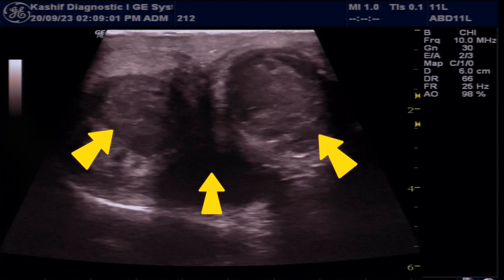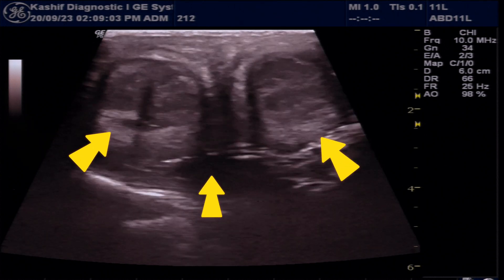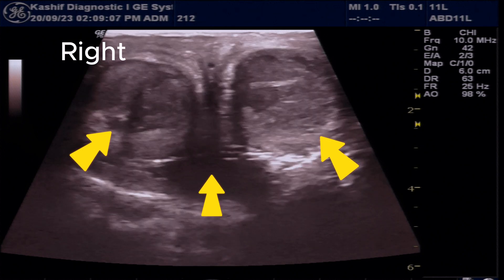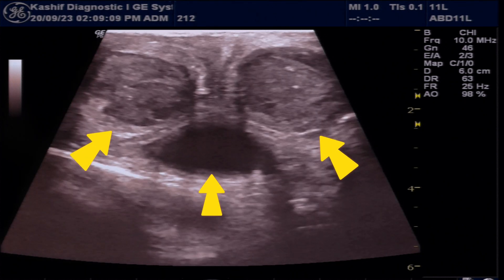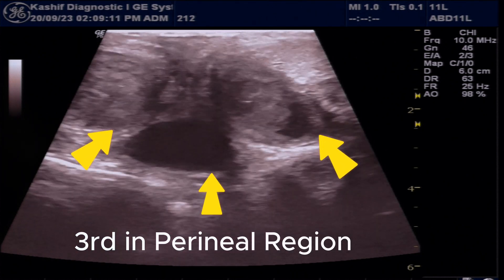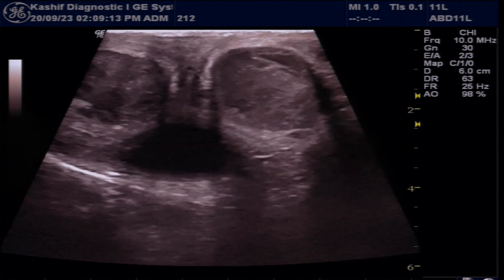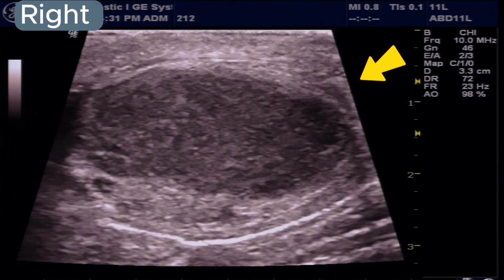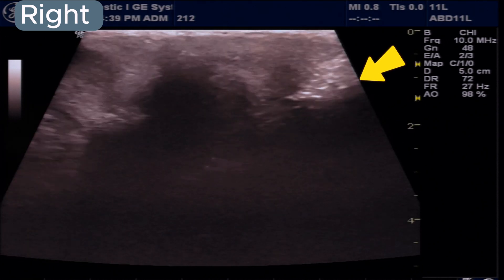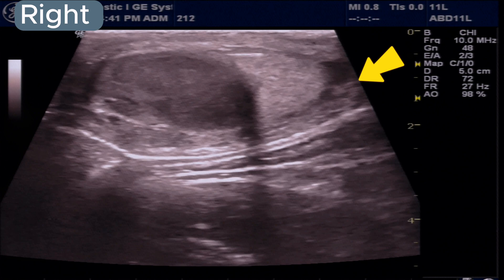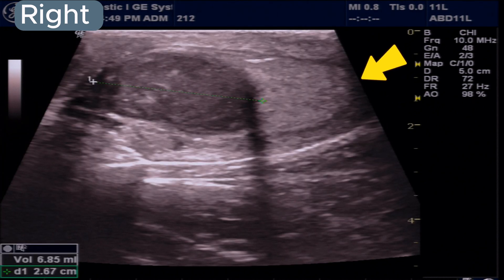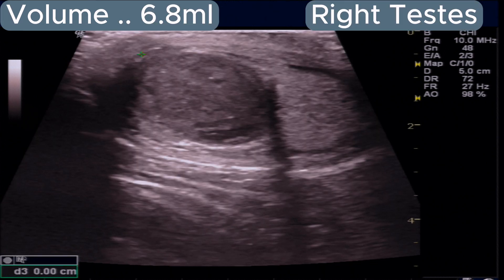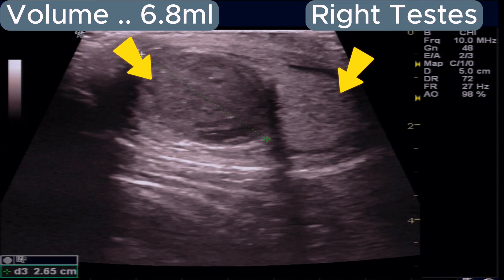We can see three extra-testicular cystic masses with thick fluid — one in the right scrotum, one in the left scrotum, and a third in the soft tissue posterior to the scrotum in the perineal region. The right extra-testicular cystic mass is filled with thick hyperechoic fluid, located lateral and posterior to the testis, with a volume of 6.8 ml.